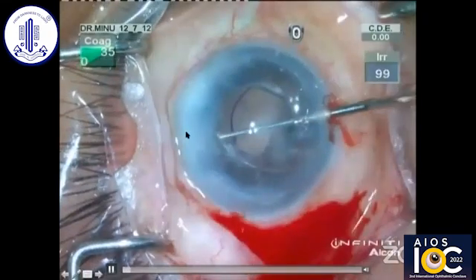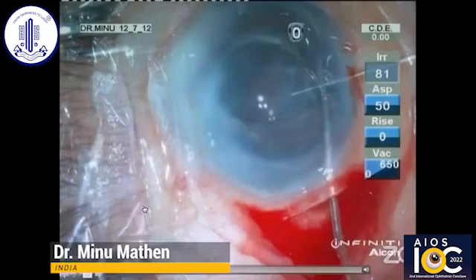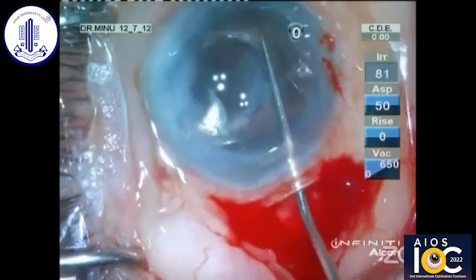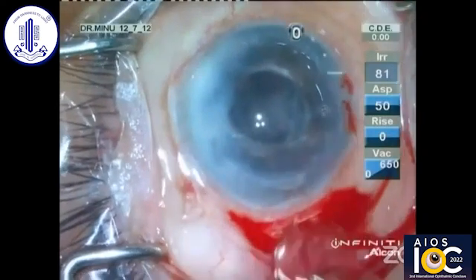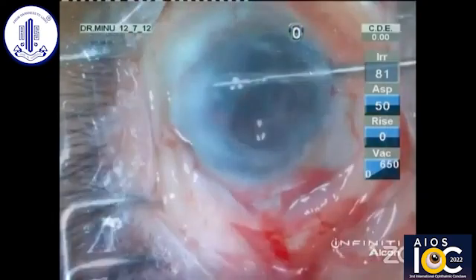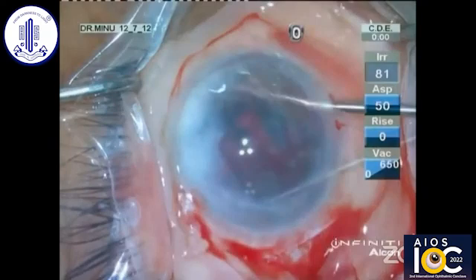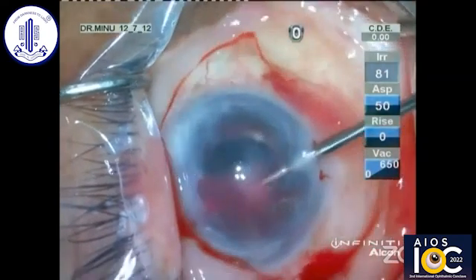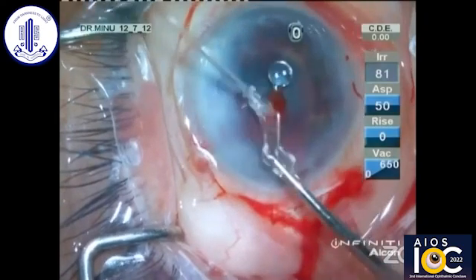AC IOLs — sometimes the IOL itself is not to blame, but if not well placed, it can create very bad complications such as corneal decompensation, glaucoma, and fibrous growth. The haptics might get stuck within membranes, within the angle, within the iris, making removal difficult. If it is not getting rotated and doesn't come out with gentle maneuvers, we can snip off the haptics with Vannas scissors. The optic can then be taken out more easily, and we can go at the haptics from different angles and maneuver them out of the erosions and adhesions more atraumatically. Bleeding is a major risk if you pull drastically without control, but pulling in different axes along the haptic allows easier removal.